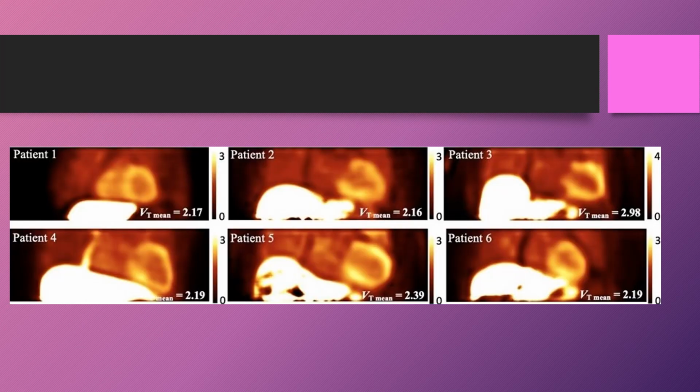And this is an example of cardiac amyloidosis accumulation.